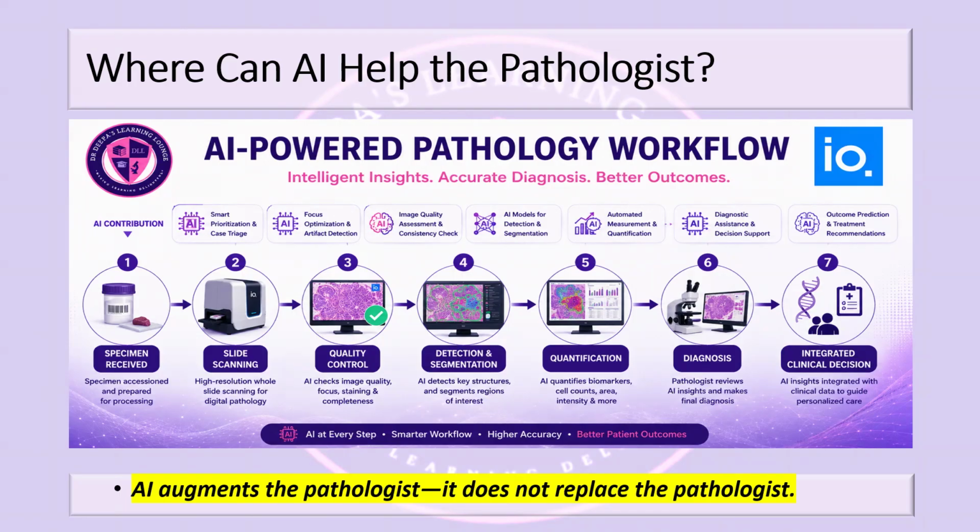But now AI can actually reject these cases in which the whole slide image is not clear. It will just not take it in. So that is called a clear quality control in which the AI can help you detect an out of focus image or tissue folds or a cutting artifact or some scanning artifacts or some knife that is blunt and the sections are not taken too well, the slide itself is not good. So all of these quality control checks can be integrated to AI. So the AI will not make you work on that also. These issues, once they are identified early, you don't have to waste your time on repeated reviews, and your TAT delays need not be explained to this, right? So it starts your work right before.